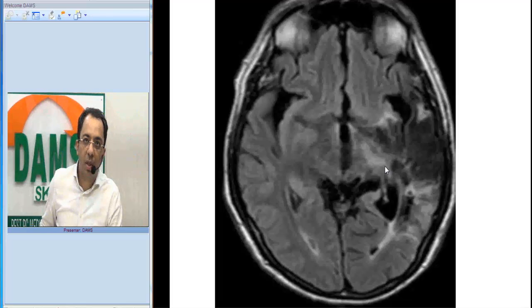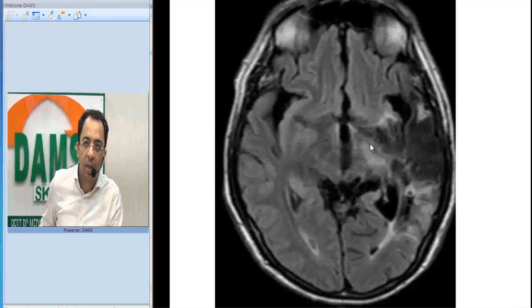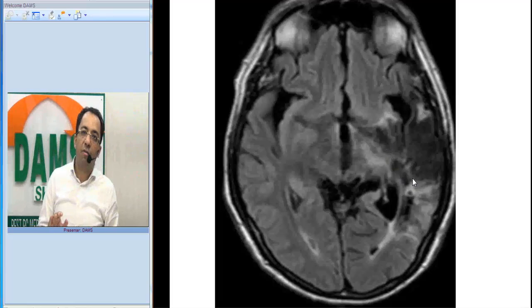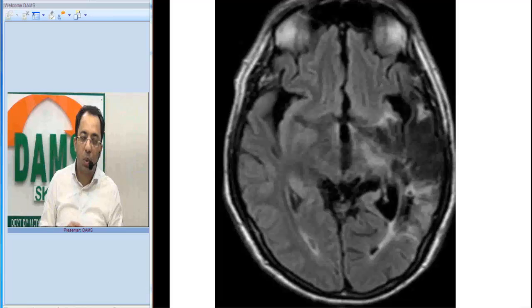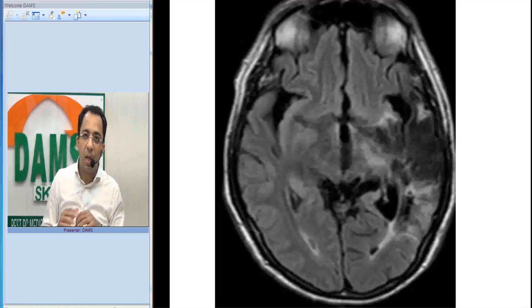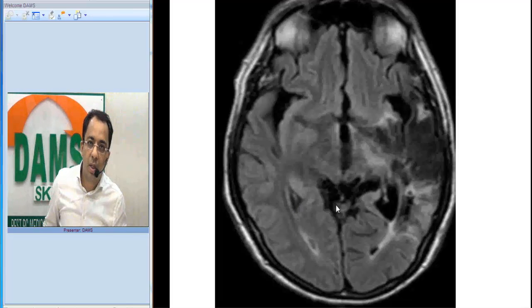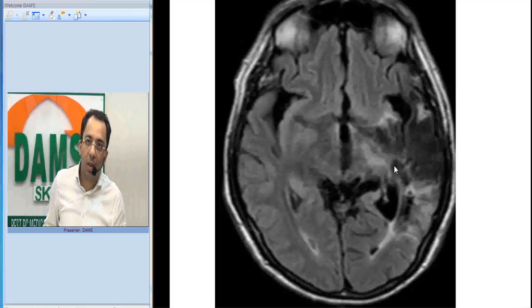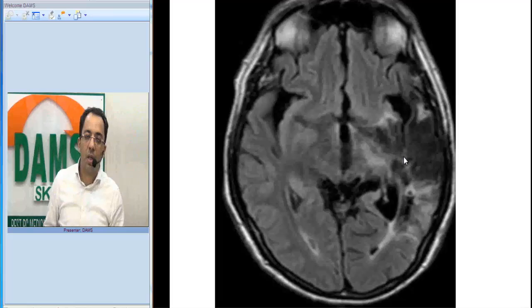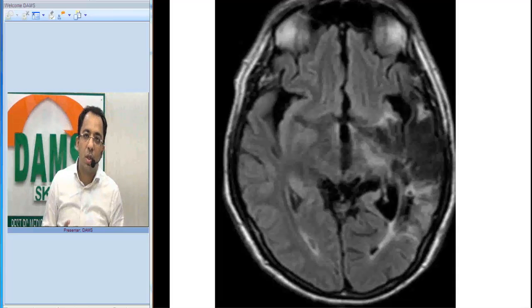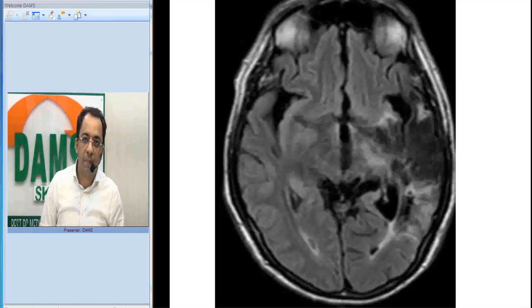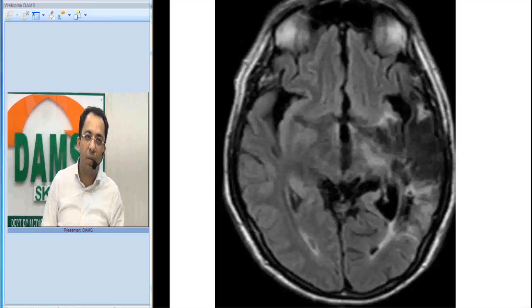So where is the abnormality? You can see there is an abnormality in the left MCA territory. This abnormality has dark areas with some white areas — FLAIR areas which are iso-intense to CSF and areas which are hyper-intense. If you look at the lateral ventricle and compare it, this lateral ventricle is dilated. So there is ex-vacuo dilatation of the ventricle with gliosis and encephalomalacia in this area. We are looking at a chronic infarct — this patient has an old infarct in the left MCA territory.